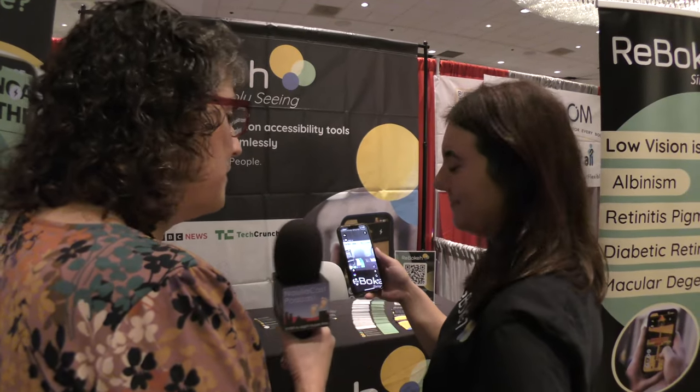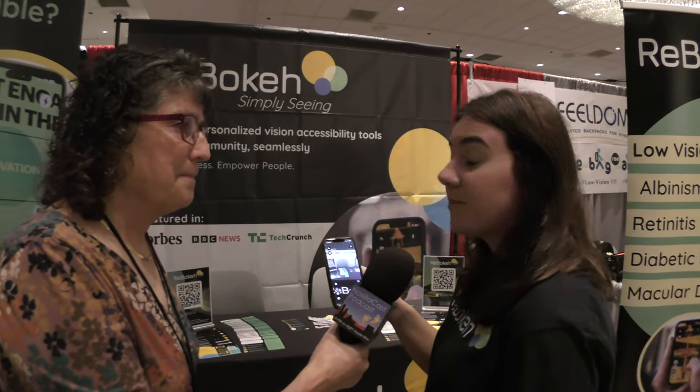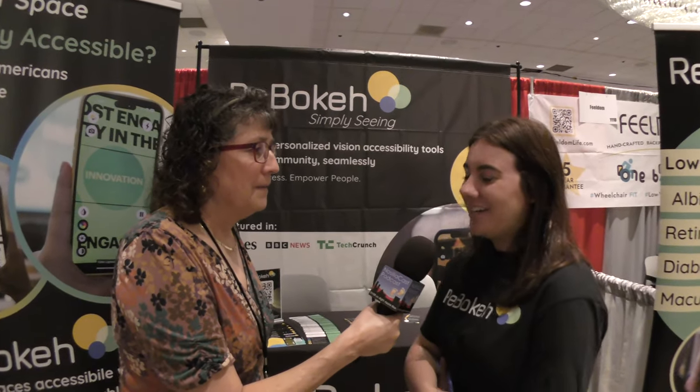ReBokeh is free to download on the iOS App Store. There's also a Pro version that gives you all the extra color combos — the generic invert color is free, and you can upgrade to get more complex inversions. Pro is $3.99 a month. The company is ReBokeh — spelled R-E-B-O-K-E-H — and you can find them at rebokeh.com.